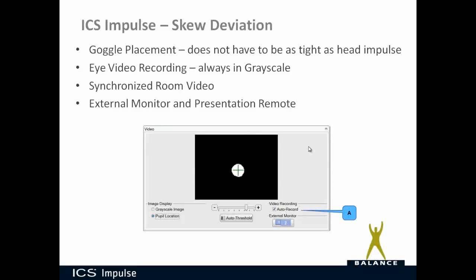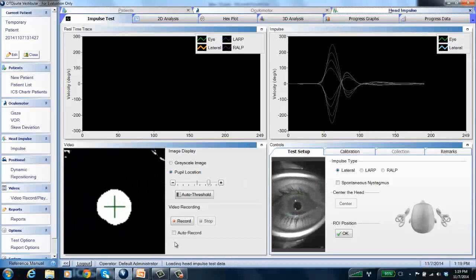The synchronized room video allows you to record the room or the patient. For the external monitor, if you click this button here, you can put the image of the eye up on a large external monitor as well as on your laptop. The presentation remote allows you to start and stop the test, but most importantly, it also allows you to note when you covered and uncovered the eye. I think the test is much easier by using the presentation remote than by using the cover and cover button on the software.